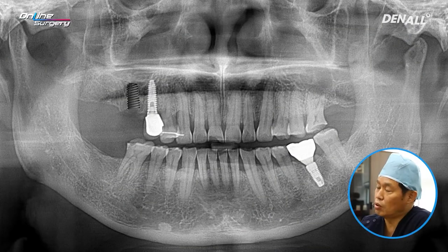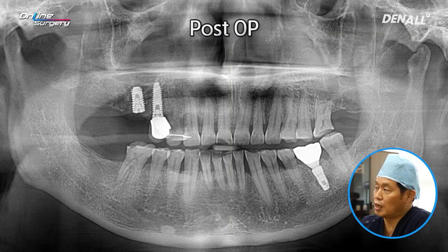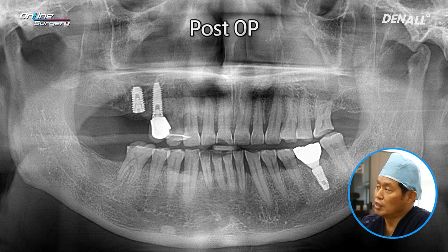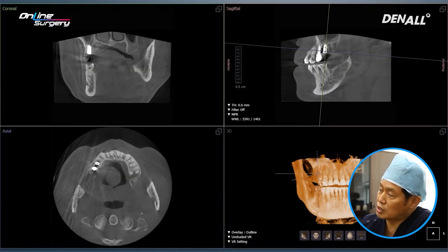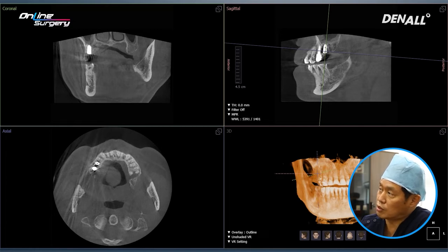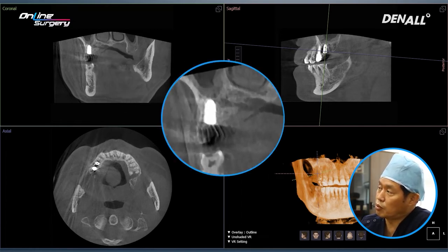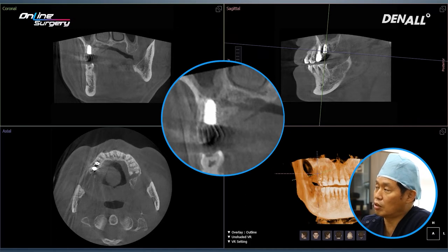The implant is going to be placed like this. On the palatal side, bone graft is going to be done. This is the post-op panoramic image. As was planned pre-op, the implant has been placed to the planned position. If you look at the CT on the palatal side, bone graft has been done. I think the patient moved a little bit while taking the CT. On the palatal side, bovine bone graft was done, collagen membrane was covered, and primary closure was done. Surgery was completed in this way.